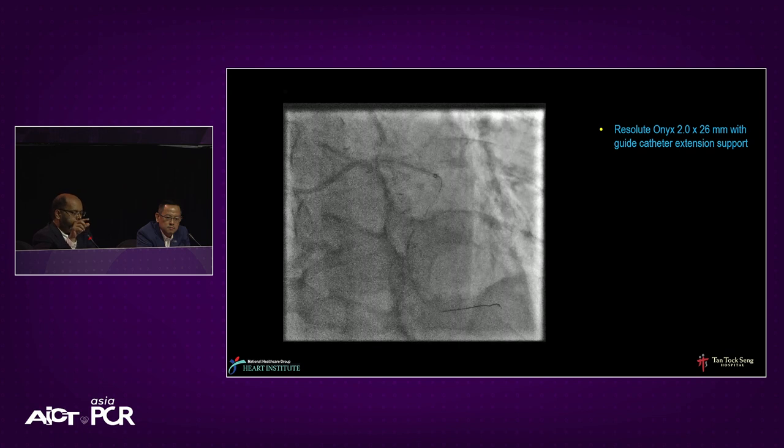However, I think OCT would be really good here because if you have calcium nodules, the calcium looks very irregular. And one thing we know now is if there are lots of calcium nodules, and even after rotablation, if you put in a stent, that can be malapposition because the nodules will protrude, push the stents inside and lead to malapposition, which can never be fixed. So in fact, a lot of calcium might actually become an indication for DCB. And that is something we have used quite a few times and demonstrated. So I would struggle to make a decision here without further imaging.